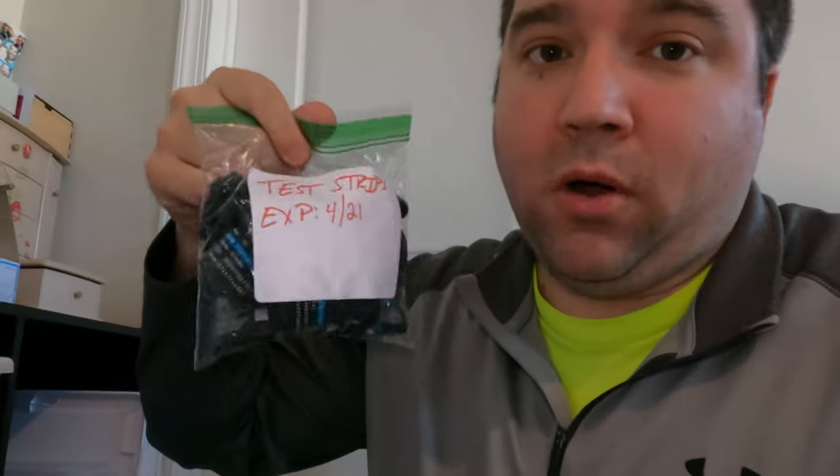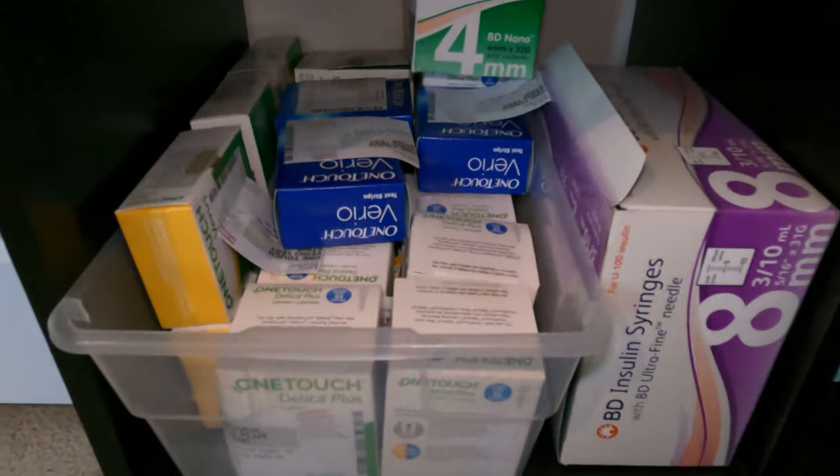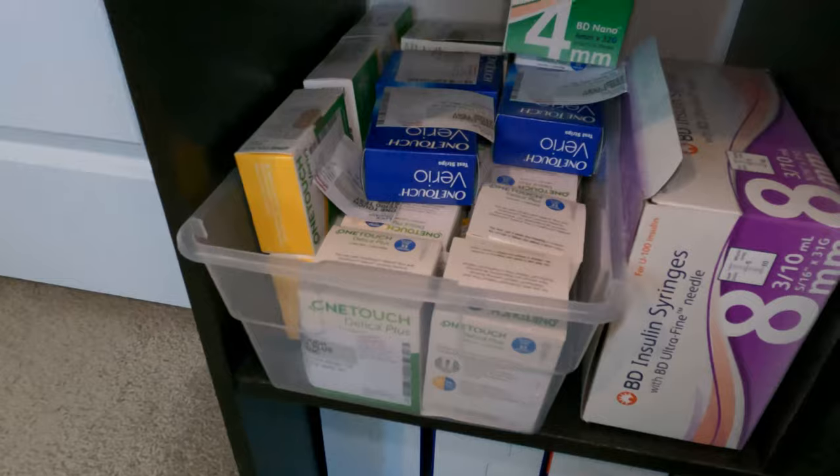Another thing we use to help organize are simple Ziploc bags. We put all of our test strips in a bag and mark them with the approximate expiration date — these say 4/21, so they range from April to June 2021. We also have a tote with lancets and other vials of test strips that aren't going to expire within the next two to three months, which is why those ones are in the baggie. We also like to keep some extra syringes on hand just in case.